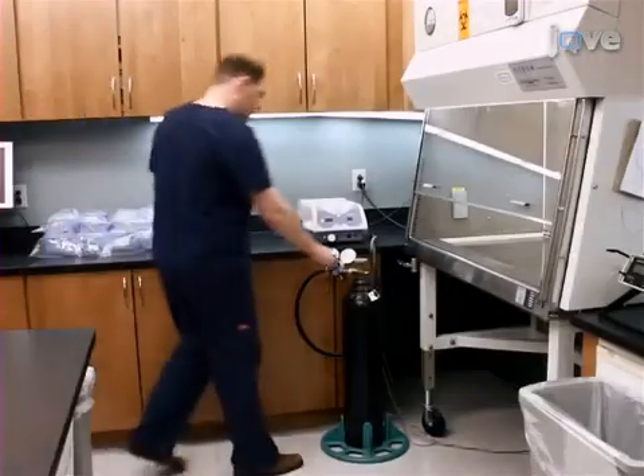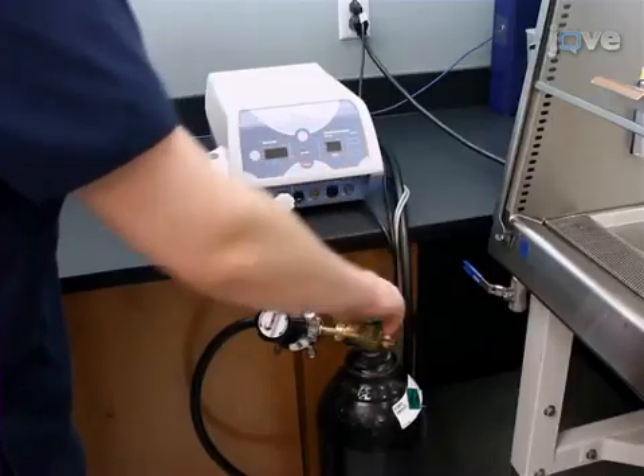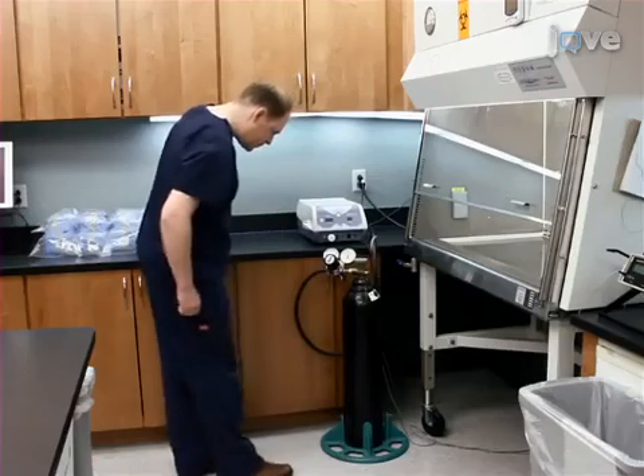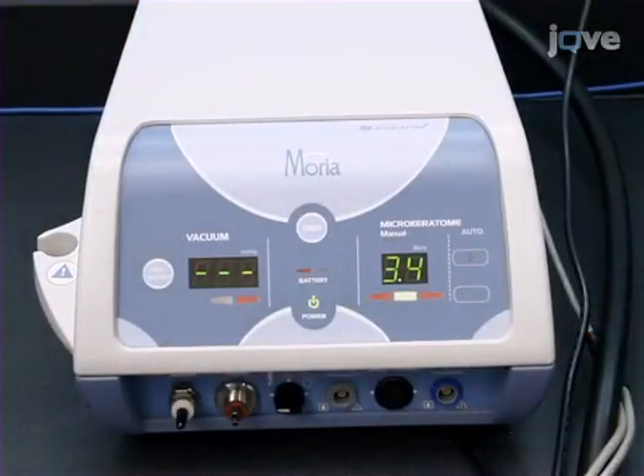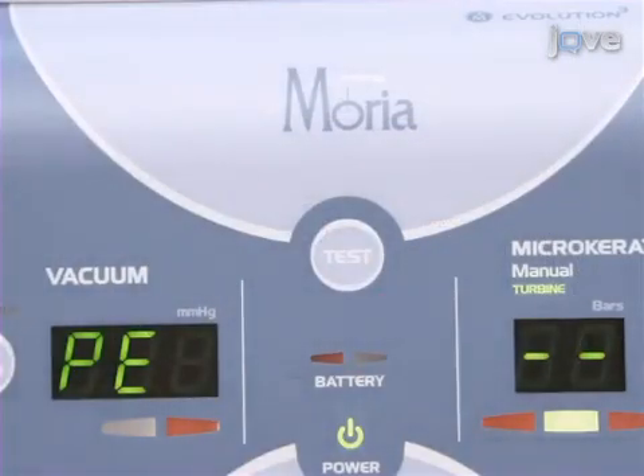Begin by turning the nitrogen gas on in the laminar flow hood to 50 to 60 psi. The turbine pressure on unit should read 3.3 to 3.4 bars. Ensure the pressure on the Moria console is in the 700s.